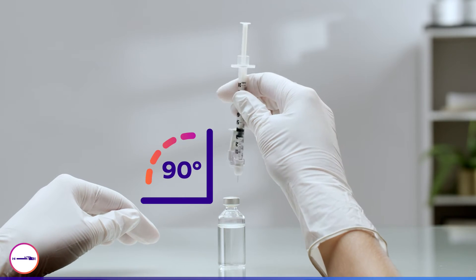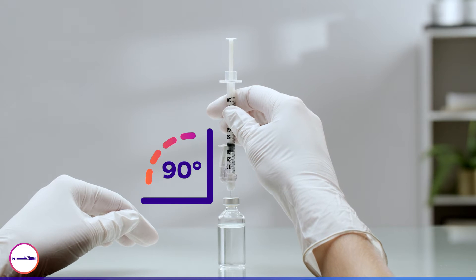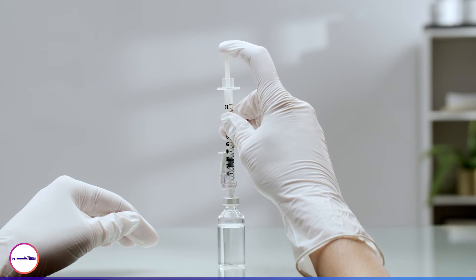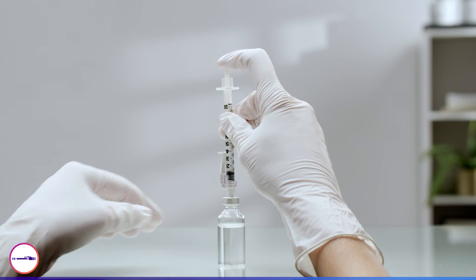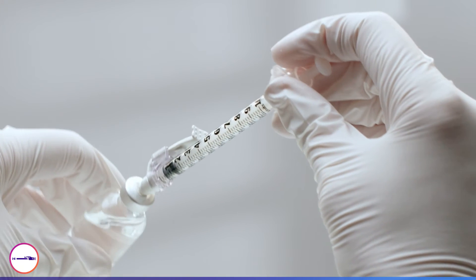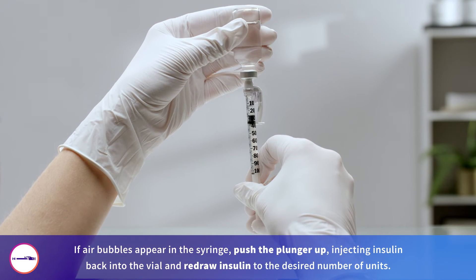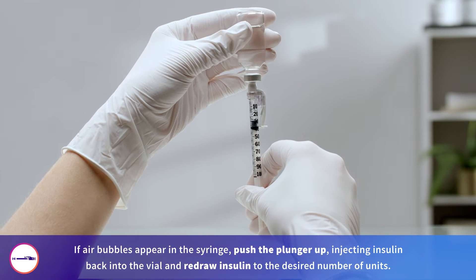Puncture the center of the vial at a 90 degree angle to avoid needle damage. Push the plunger down completely. Turn the needle and vial upside down. Finally, draw up insulin into the syringe by pulling the plunger out to the desired unit.